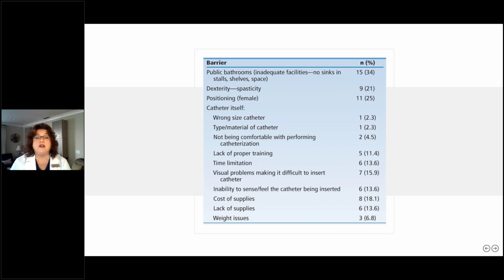And she was actually, of course, because she was used to feeling things, easier to teach than patients who had vision. So I found that very interesting. She did very, very well with hers. And she was thin enough, she was the right everything, and it was all by feel. So it worked out really well for her.